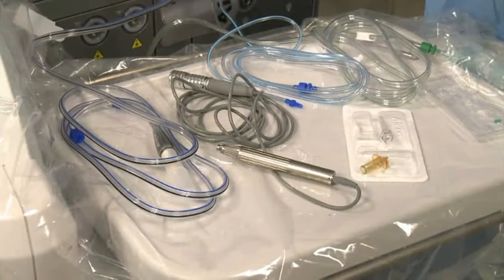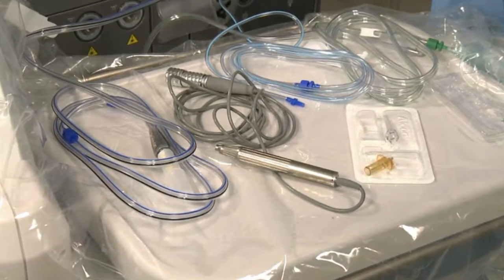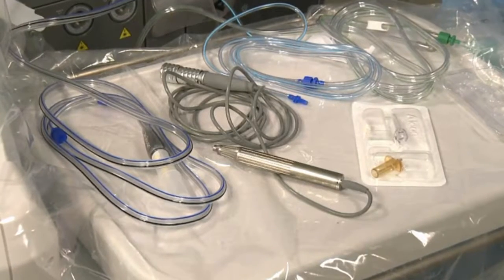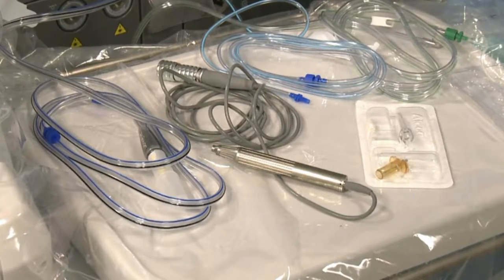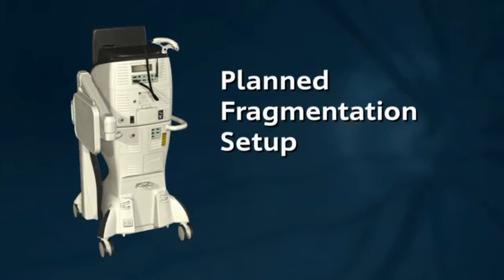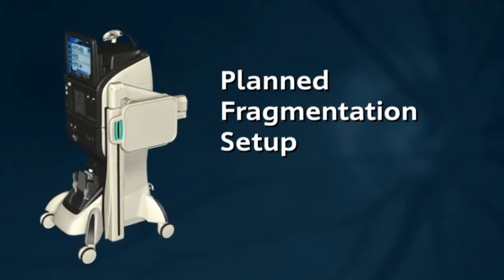There are two methods of setting up the fragmentation function on the Constellation system. The first is before the case begins, also known as a planned fragmentation, or second, during the case, also known as unplanned fragmentation. The following method describes the planned fragmentation setup. This takes place during the initial setup of the posterior vitrectomy cassette.